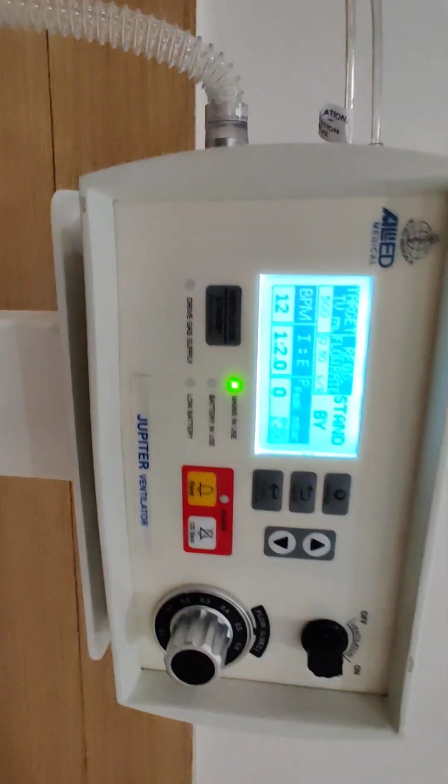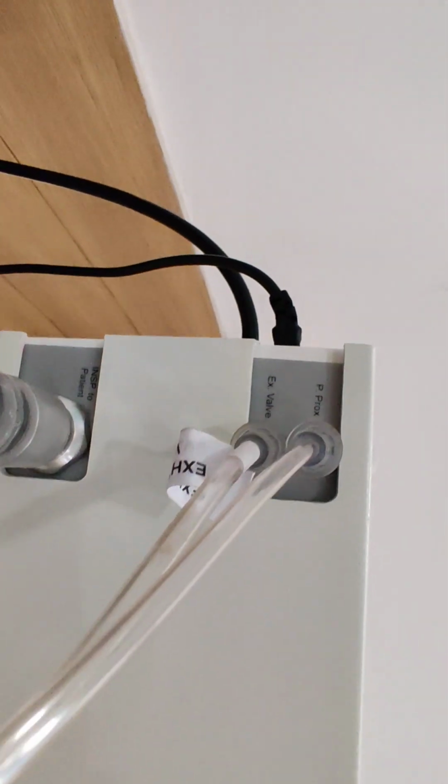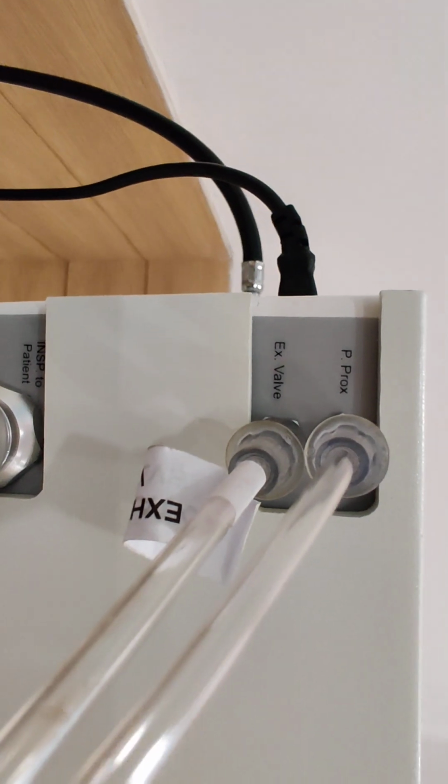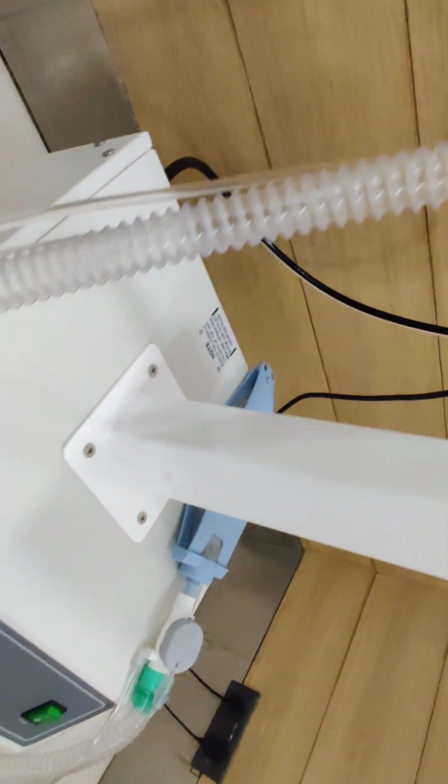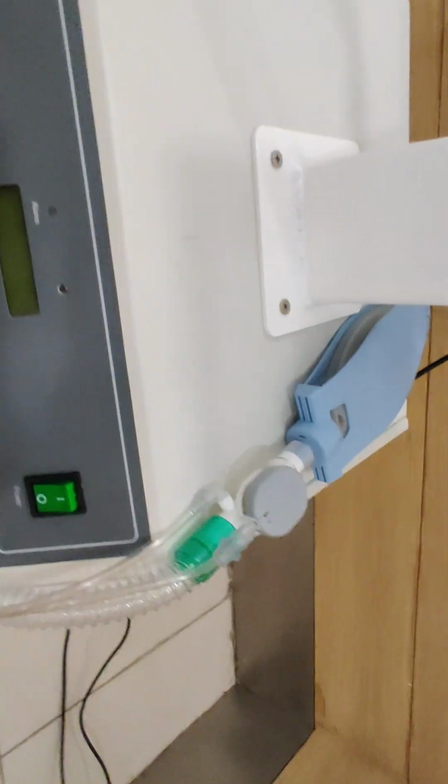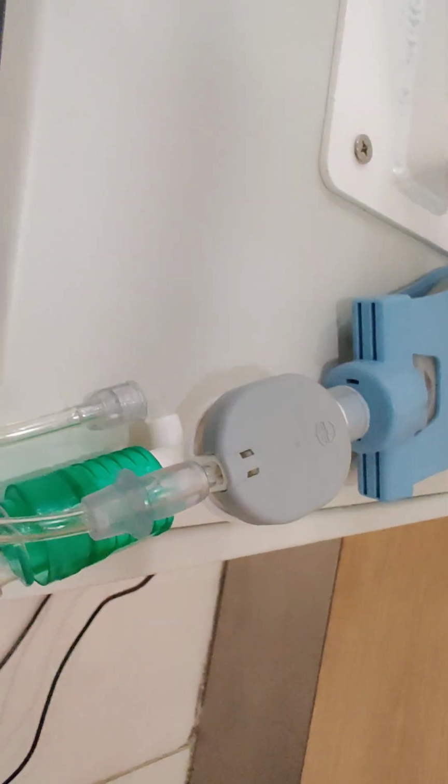This ventilator runs with a single limb circuit, which is connected on the side of this ventilator over here. This is the patient tubing, and we have two lines over here. One is P proximal and one is the exhalation valve line. The P proximal line is used for measuring the airway pressure of the patient, and this expiratory line will be controlling the expiration valve, which is on the patient's end of the circuit, the patient tubing over here.